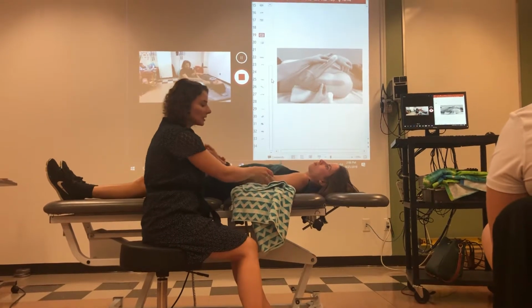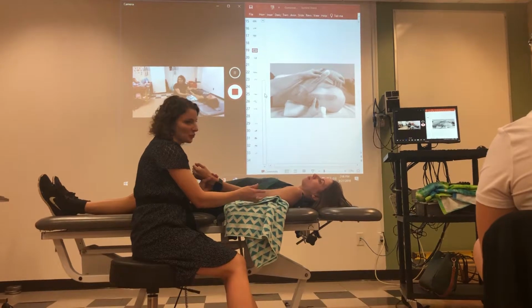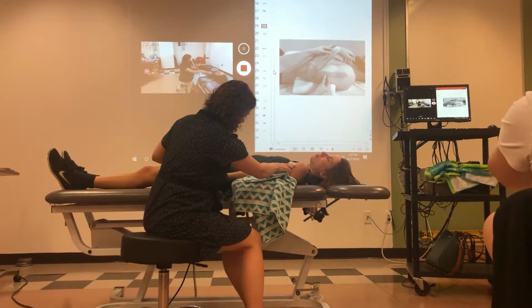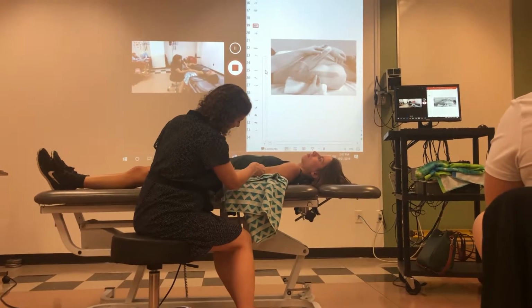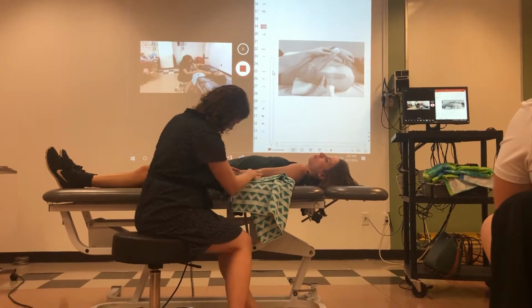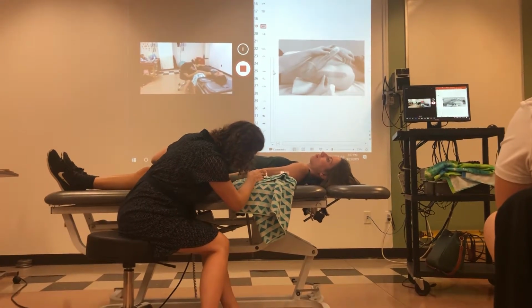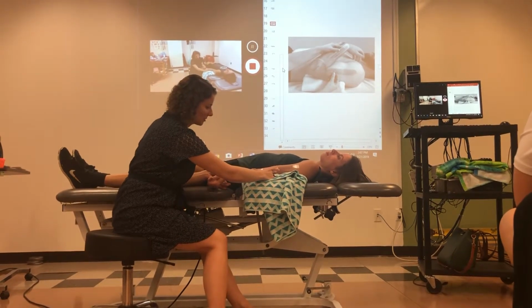And then extension, really you're only going to be measuring extension if you notice any significant deviation from 0. So if they do have a hyperextension, you would certainly be using the same landmarks going into that end range. And then aligning the lateral epicondyle, midline of the humerus, to the greater tubercle, and to the radial styloid. And she maybe has mild hyperextension, just like 2 degrees of hyperextension.